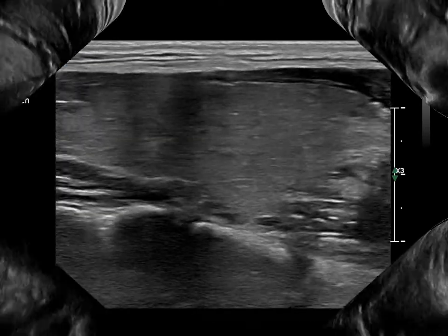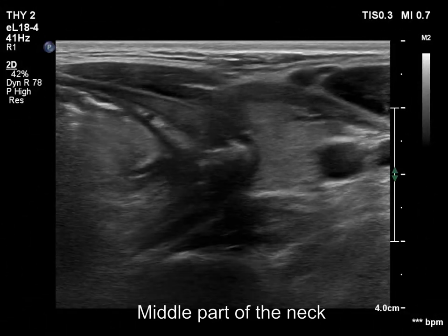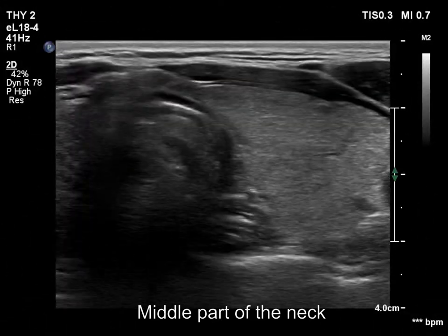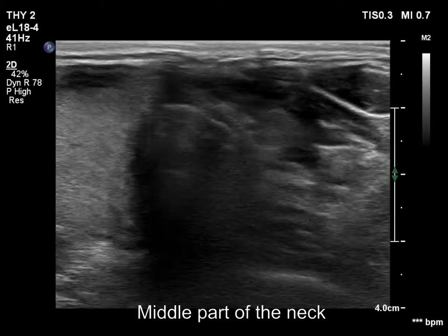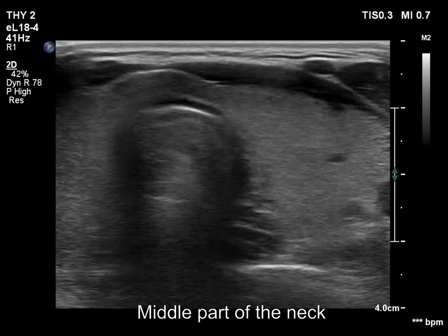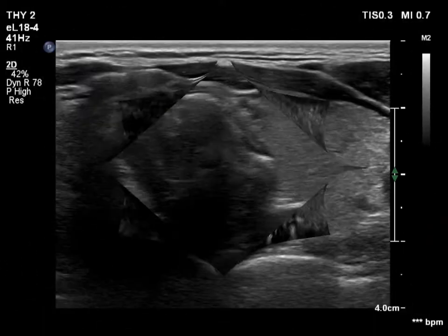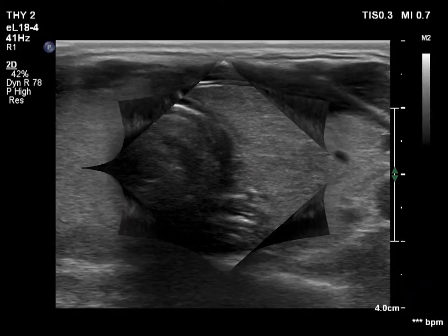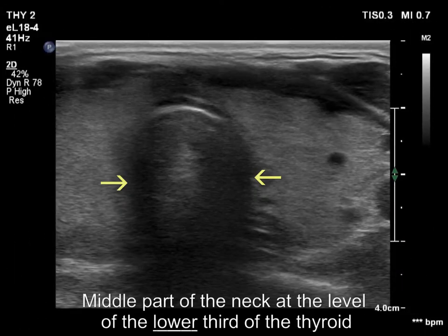We present now the trachea, first at the upper, now at the lower level of the thyroid. The width is normal at the upper level, while the trachea is narrowed at the lower level.